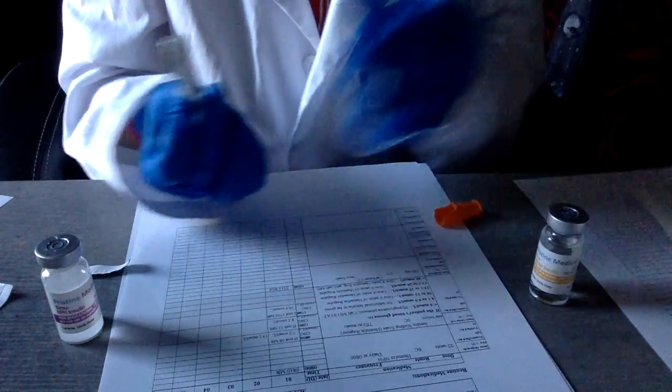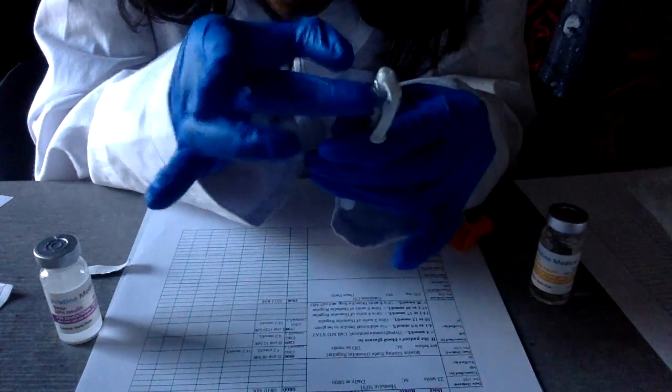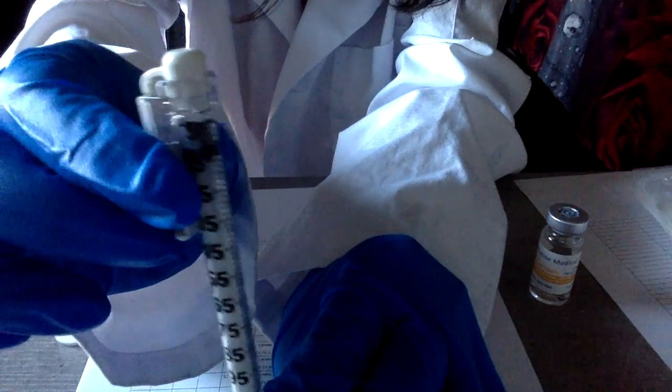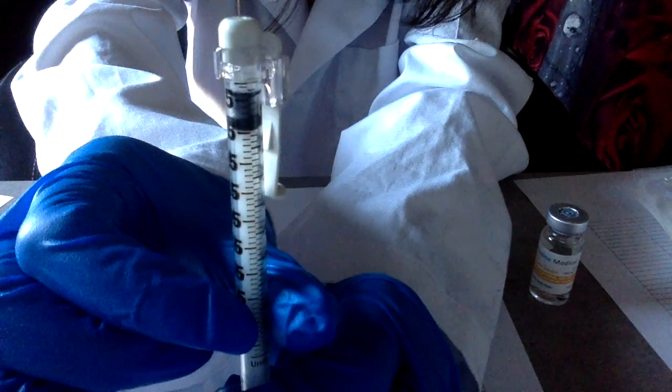Check for any air bubbles. 4, okay. Four.